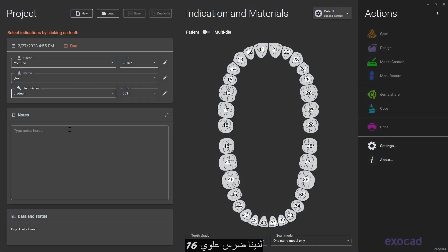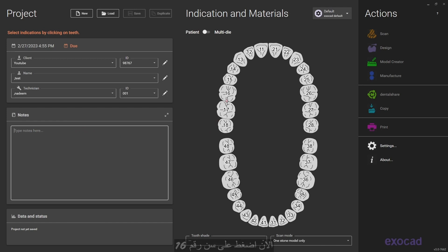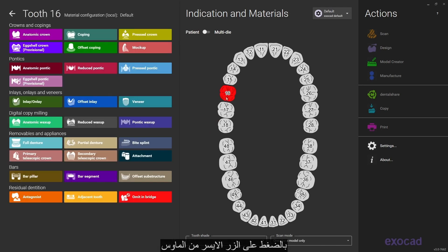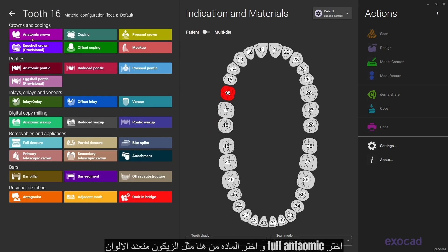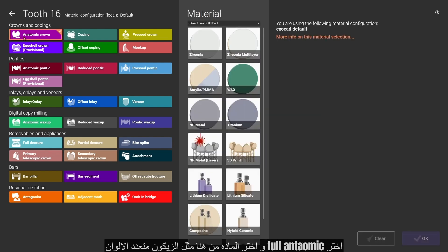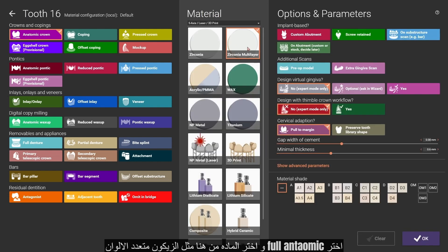We have upper 16. Now press on tooth number 16 by clicking the left mouse button. Choose full anatomic and choose the material from here, like zirconia multi-layer.